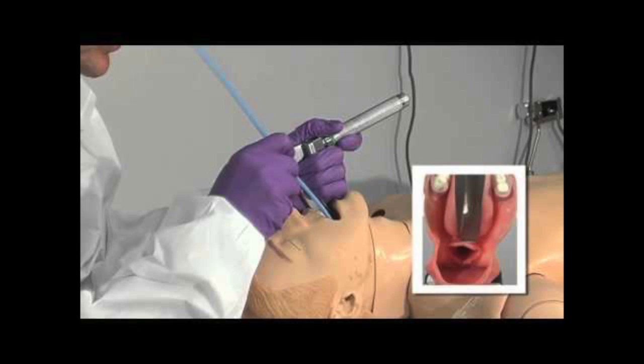Find those cords, snake it into the trachea, and I'll know I'm in the trachea because I'll actually feel the tip of that bougie clicking along the cartilaginous rings of the trachea. I know I'm in the right spot. And I'll continue to push until I hit the carina, and then the bougie will actually stop. It won't go any further. So those are indicators for me I'm in the right spot. Then I'll take the ET tube, and I'll thread it literally over that bougie, and it can only then go into one place. It slides directly into the larynx, into the vocal cords, into the trachea. So it's a 100% success rate. It's perfect. Well, now, obviously, I hold on to the ET tube, and I pull the bougie out, and now that tube resides in the proper spot.